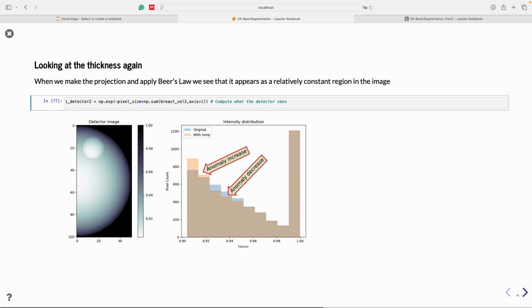And the other thing is, it's not always that you have the healthy case radiograph. It's more like the exception. In particular for mammography, there is this regular screening, and in that case you could actually tell from that, but still the histogram is not the tool that you should use to compare. But here we just look at it for the model's sake.